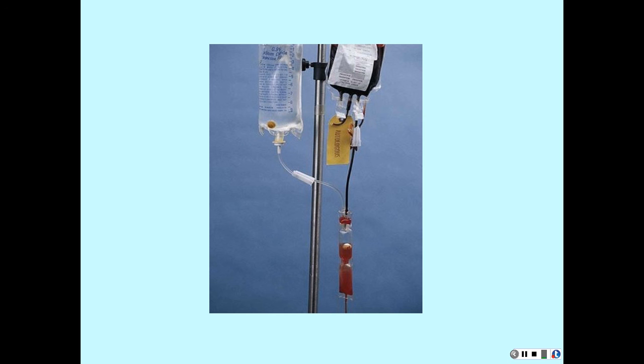It's just priming the tubing, and then to flush your blood too. Because if your patient starts to react, you may want to flush that out, and I see what you're saying. Yeah, you can. That's why we usually hang about 500.